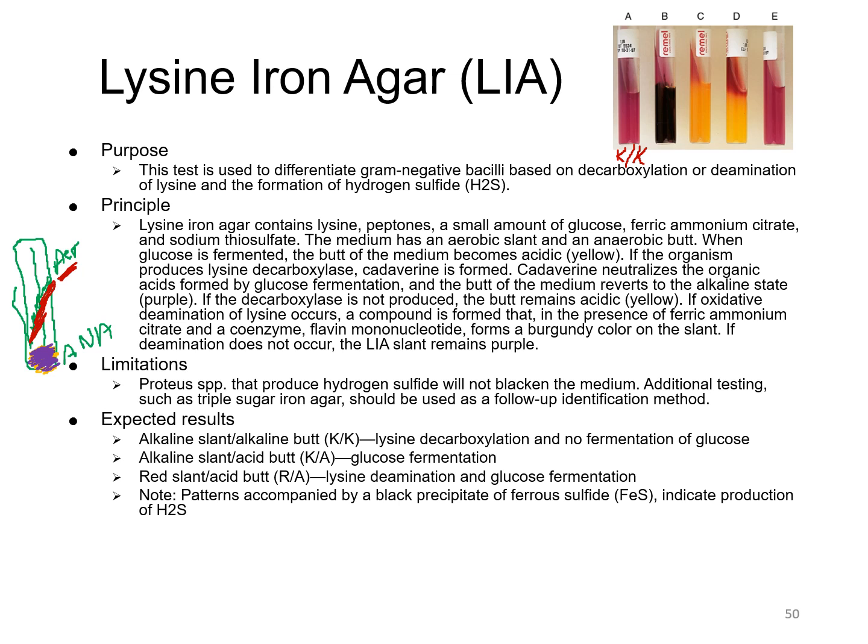Next, you have an alkaline, and probably an alkaline, but it does have the H2S production, so it has turned that agar black.